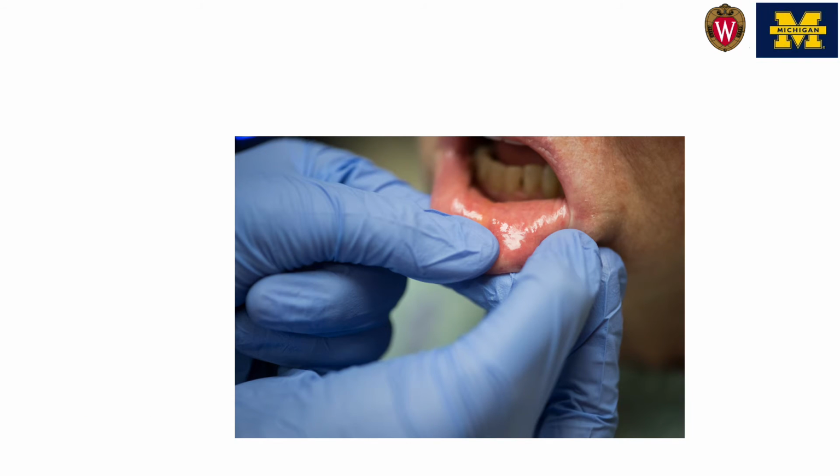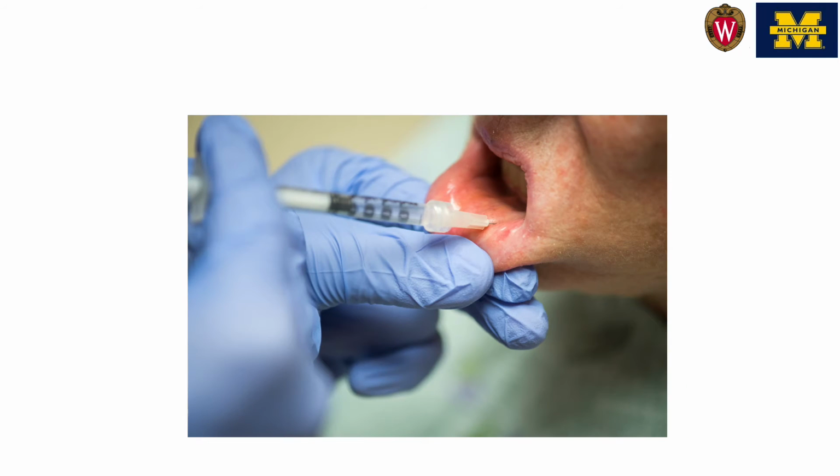Step 1 in the procedure is to identify labial salivary glands. Here you can see in the light these little bumps, and these little bumps are the labial salivary glands. We're going to want to pick a location that's halfway between the angle of the mouth and the middle of the lip, and also halfway from the vermilion border to the gums. And that's going to be the site of our incision, as you will see shortly.